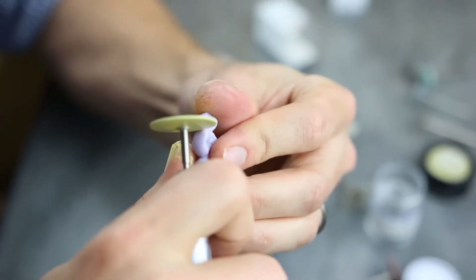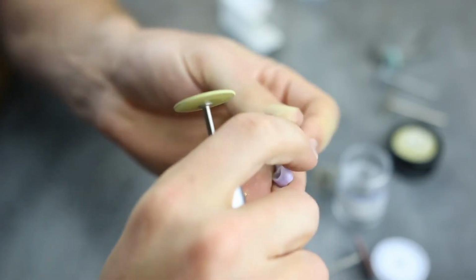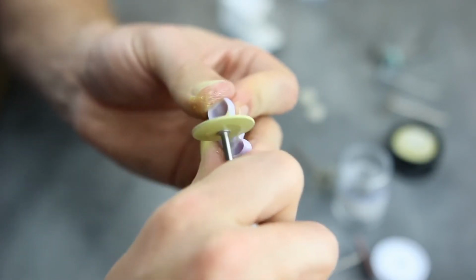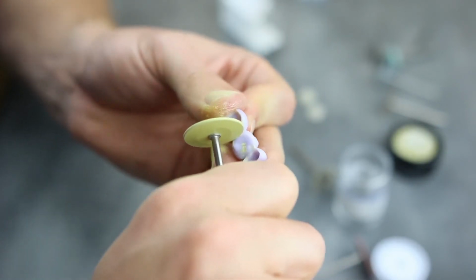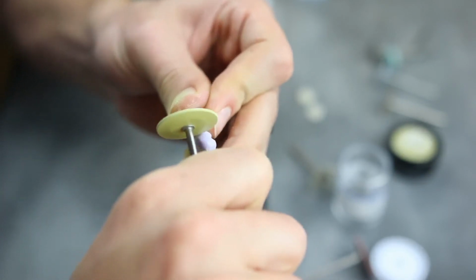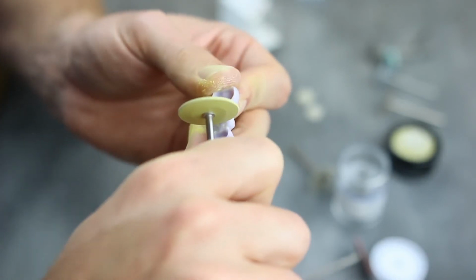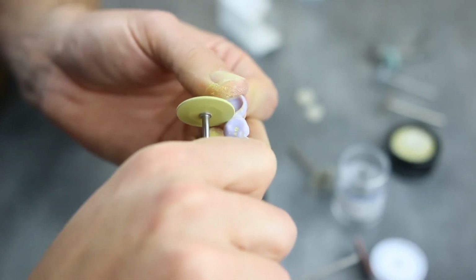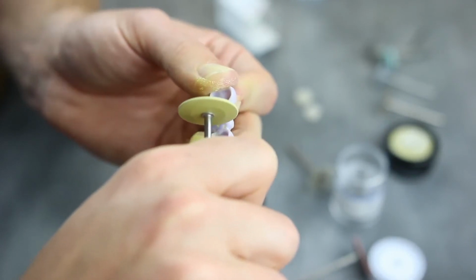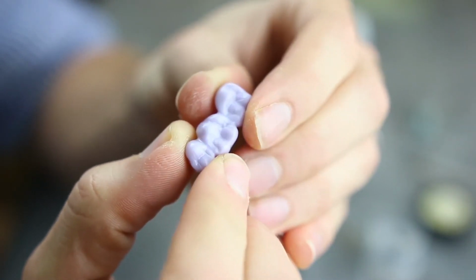So we use this on all of our smooth surfaces, buccal, lingual, palatal, obviously underneath the pontics on bridges like this one. And then I just work it into the interproximals as well, just to get that high shine, which is really, really critical when we're using bonded resin cements. These days we want to make sure that our bonded resin cements don't stick to our ceramics. So having a high shine or a high glaze finish on the interproximals means that it's much easier for cement removal in those areas.